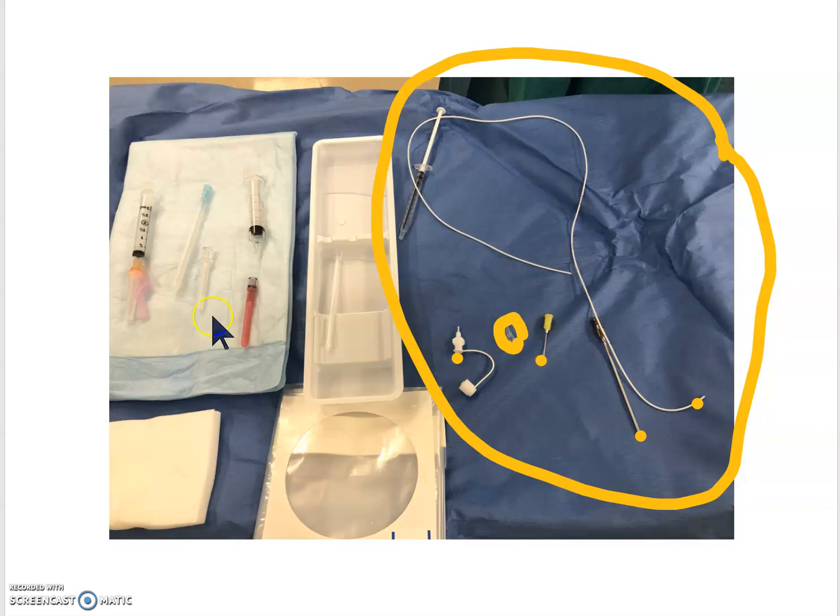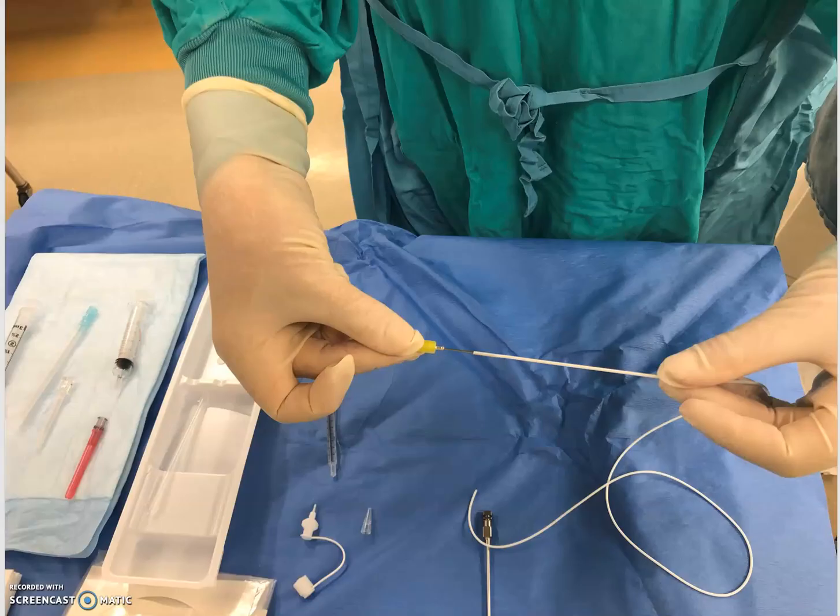On your set you will need local for infiltration in the skin. You'll have your drape, some saline which you'll use to flush the catheter, and a syringe that you will use to flush the catheter as well as aspirate from your catheter once it's in.